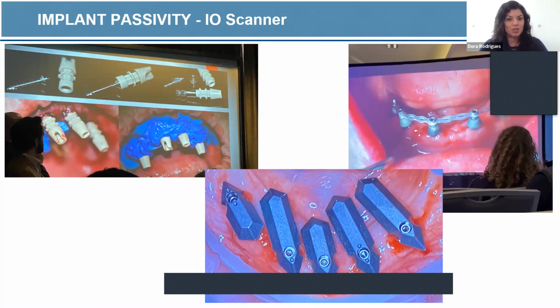So these are just a couple of examples, but for me as a technician, these are not the right ones to incorporate in my business because they involve intraoral scanning. Most of my doctors don't have an intraoral scanner. I have one, so I cannot scan the patient, and I cannot ask my doctors to scan the patients with my scanner. These are just some options out there that doctors say work, and people who use these workflows believe in them and use them. But for me as a technician, that wouldn't be possible just because it's not ideal. I'm bringing the workflow to my doctors.